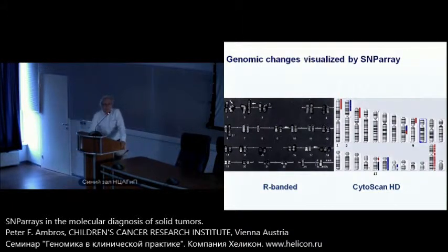But that's it. Yeah, you will ask why not stay with karyotyping. It's nice. It's a little bit laborious, but I tell you, this karyotype is 1 out of 100 or maybe less. It is virtually impossible to get chromosomes out of a tumor on a routine basis.